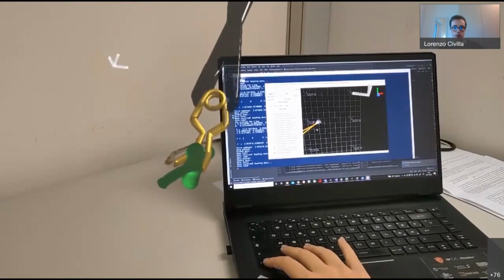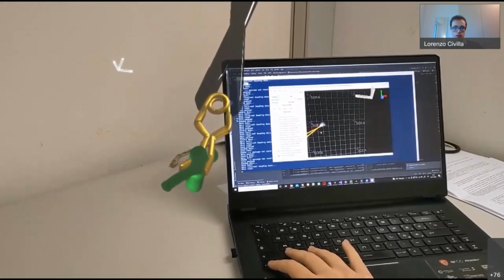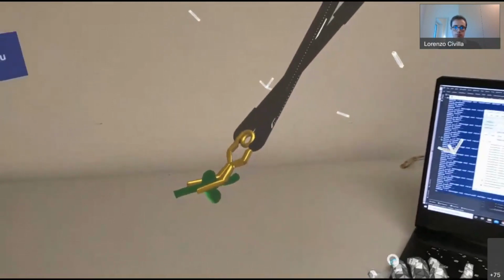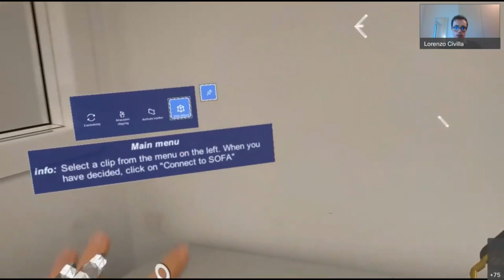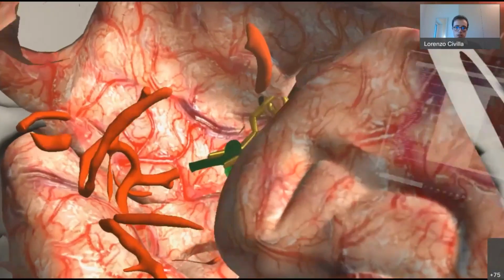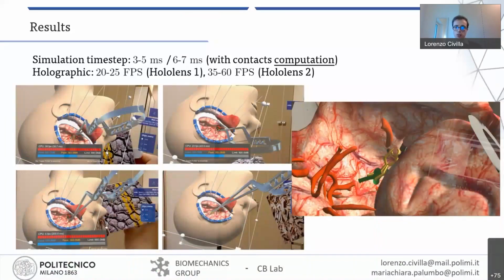You can make different attempts at positioning the clip and the holder to obtain the final desired configuration. And once the final solution has been achieved, you can activate the anatomical visualization again to see if the approach is actually feasible, evaluating intersections with other meshes.